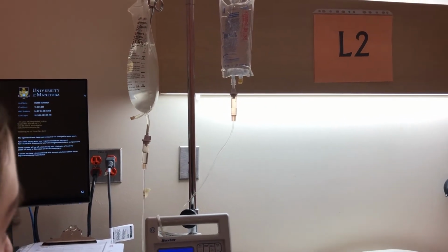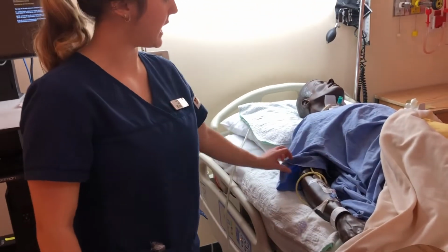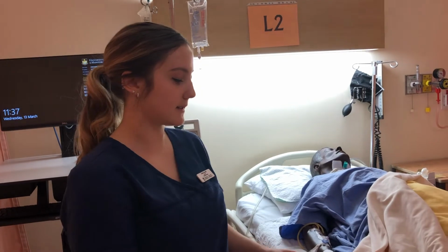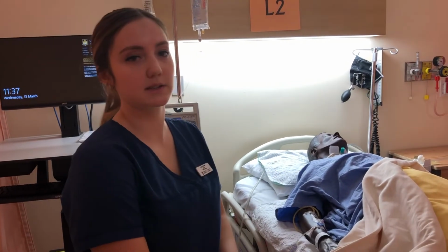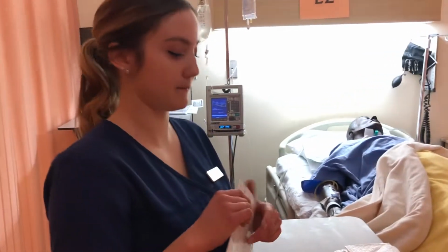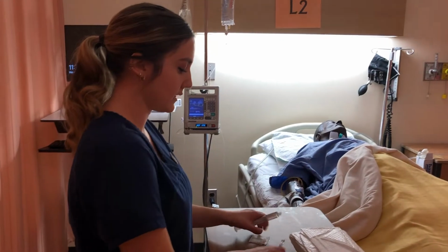So it's flowing. I would make sure that I document that I gave the medication and who the other nurse was that did their checks. And I would be sure to monitor my patient, tell her that she gets regular blood work, and monitor for any signs of bleeding. I think that's everything. So now I'm going to move on to my chest tube.